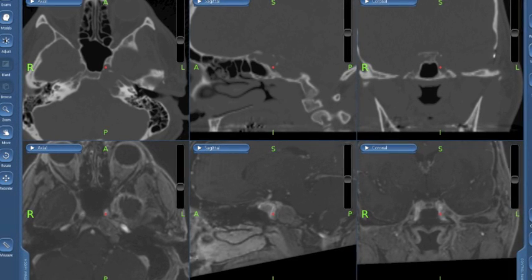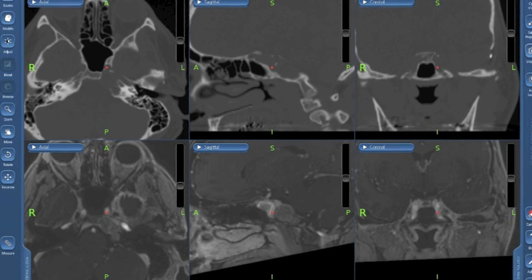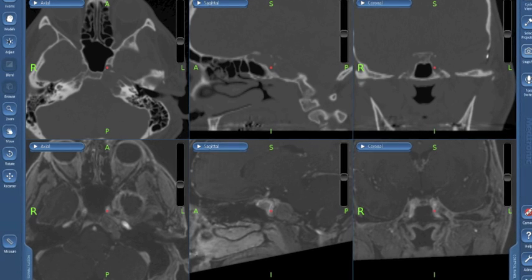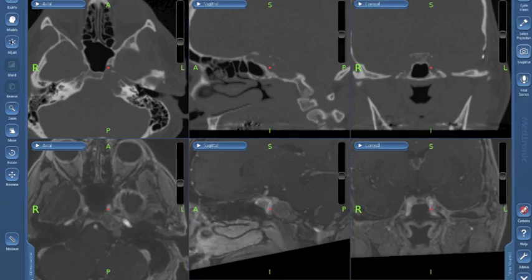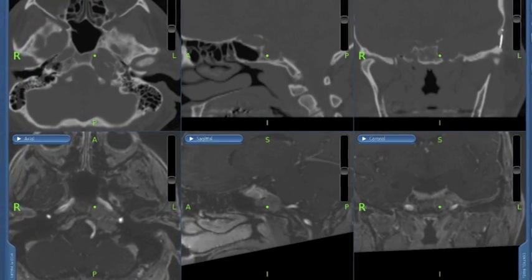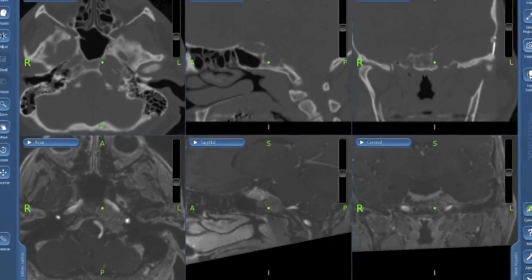Using a merged CT and MR shown here, the red dot indicates the carotid artery as we are planning this removal. We're going to stay just medial to the carotid artery. As we can see on this next view, the green dot shows an intraoperative view where we opened up the petrous apex at its medial aspect.